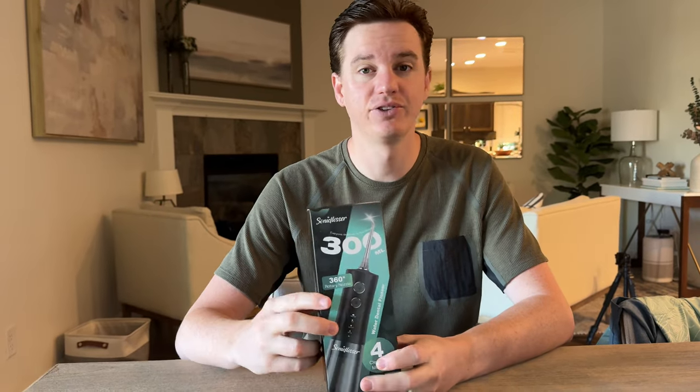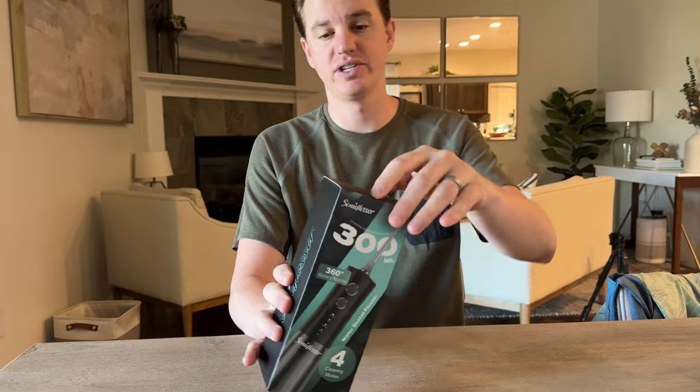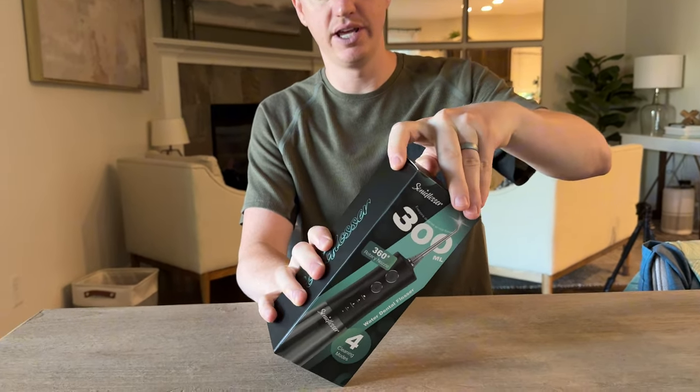I got this dental flosser in the mail to try out and give you my feedback, so let's unbox it and show you everything that's included.